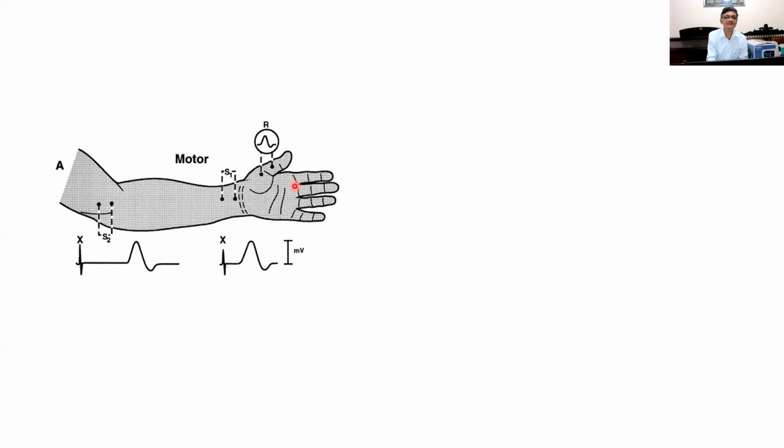Okay. So what we are recording here is motor activity, so we call these the motor studies, not sensory. We can do the sensory studies, which I am not going to talk about. Say if you put a stimulating electrode in the ring finger, there are ring electrodes. Then you record from the nerve.